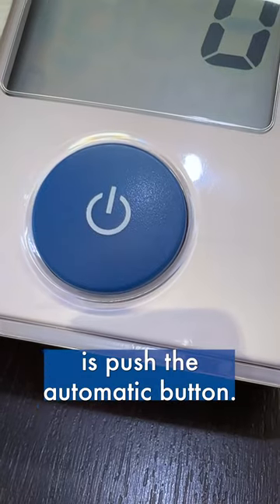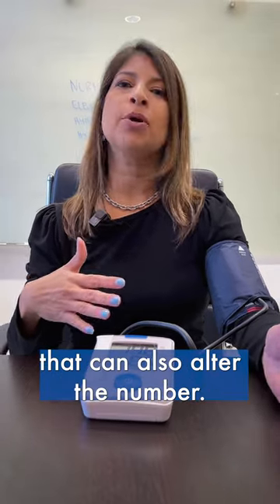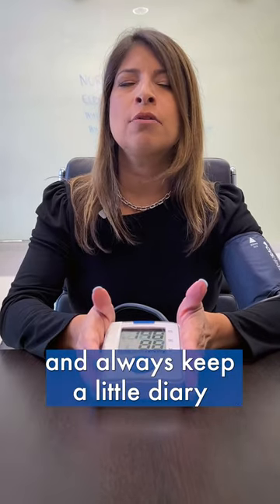All you have to do is push the automatic button. Please try not to speak while the machine is measuring your blood pressure, as that can also alter the number. It's also a good idea to take two blood pressure measurements, average them out, and always keep a little diary or record and bring it to your doctor's appointments.